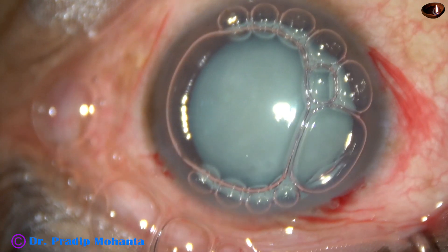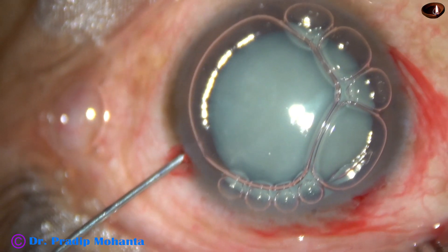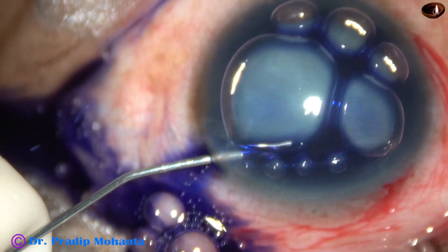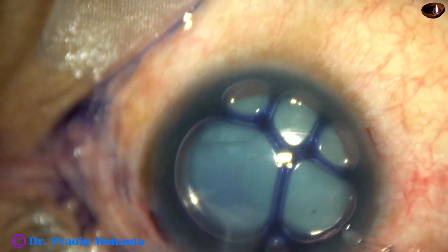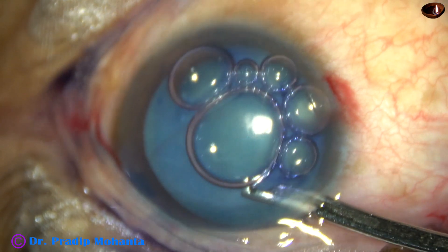And now a big air bubble is injected into the anterior chamber. Trypan Blue dye is applied over the anterior capsule, underneath this air bubble. And then the dye is washed out with BSS using a 23-gauge Simcoe cannula.